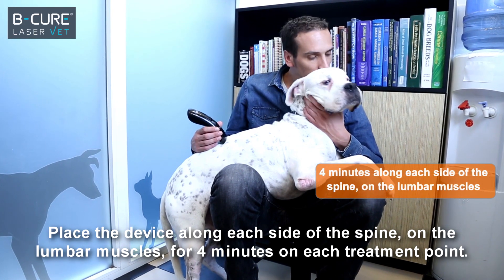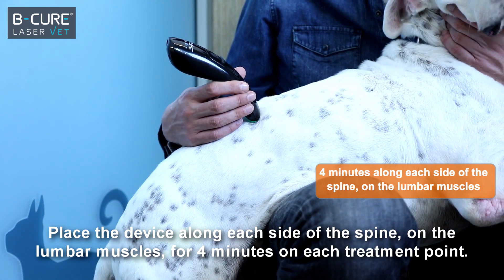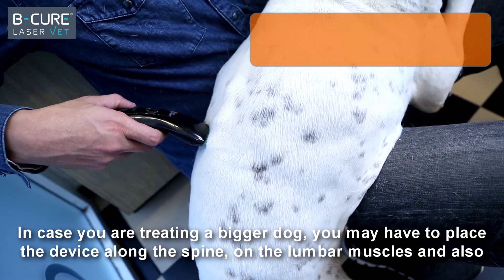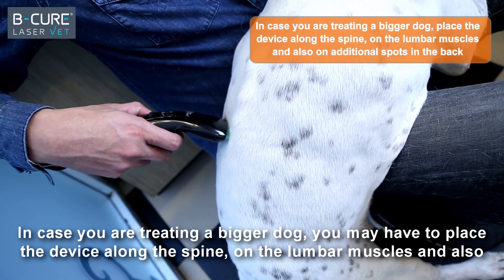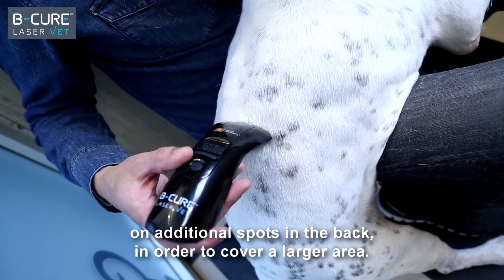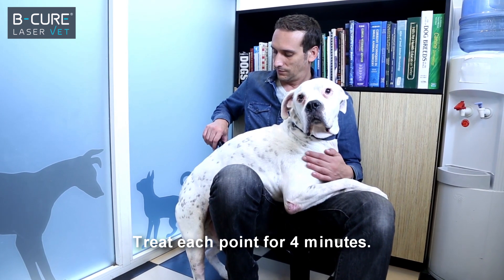Place the device along each side of the spine on the lumbar muscles for four minutes on each treatment point. In case you're treating a bigger dog, you may have to place the device along the spine on the lumbar muscles and also on additional spots in the back in order to cover a larger area. Treat each point for four minutes.